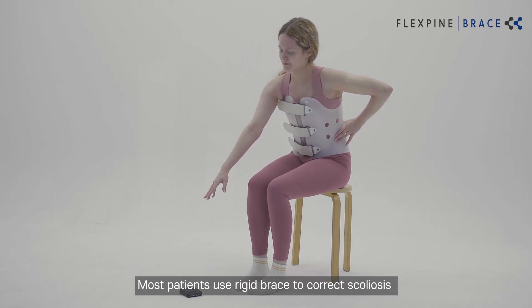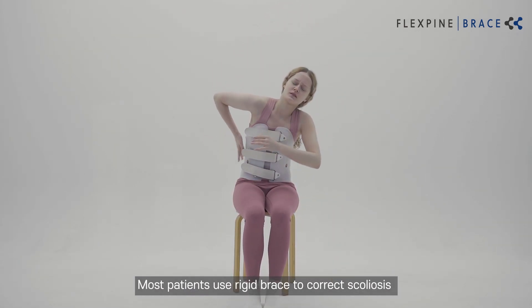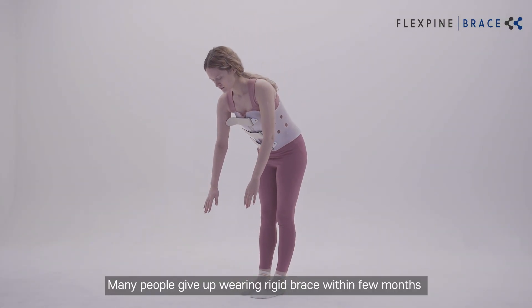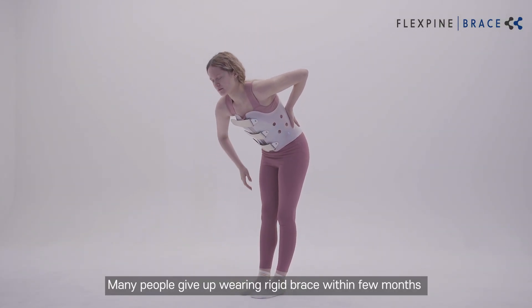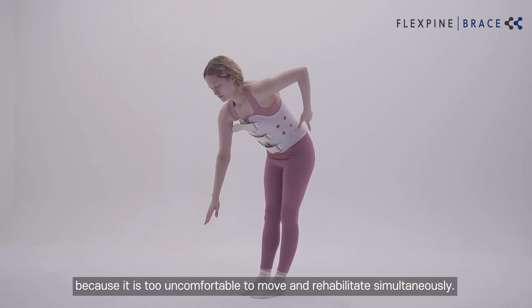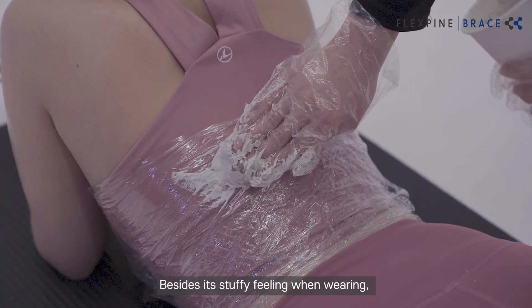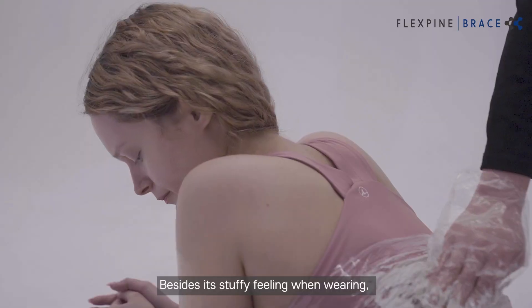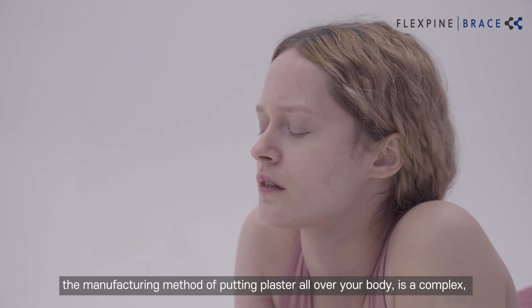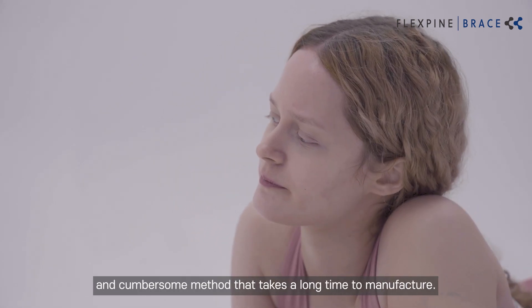Most patients use a rigid brace to correct scoliosis. However, many people give up wearing the rigid brace within a few months because it is too uncomfortable to move and rehabilitate simultaneously. Besides its stuffy feeling when wearing, the manufacturing method of putting plaster all over the body is a complex and cumbersome process that takes a long time.